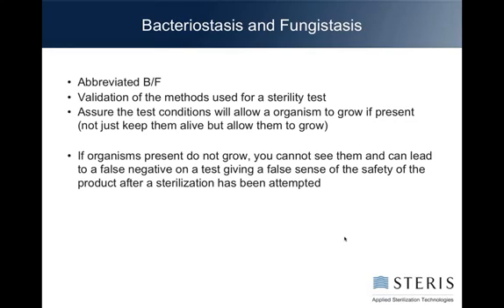We did this so far. We've talked about the bioburden half of testing. You have a test to assure the accuracy of the bioburden recovery, and then we have an accurate number that we get off of the product through bioburden extraction that we use to set the verification dose.